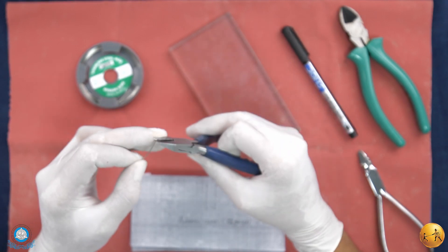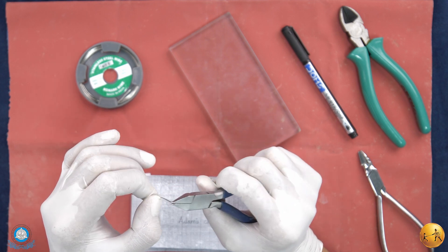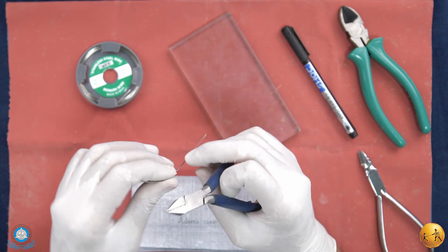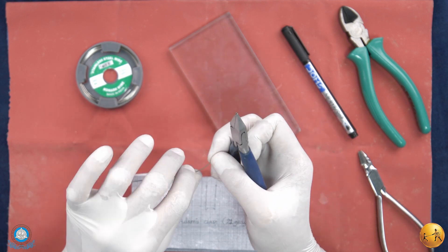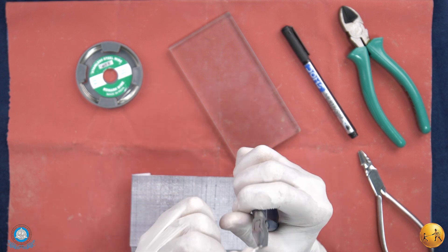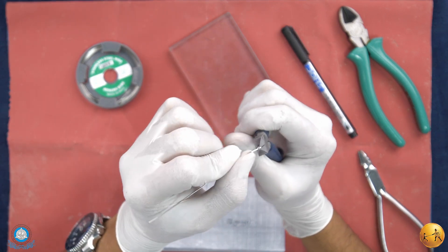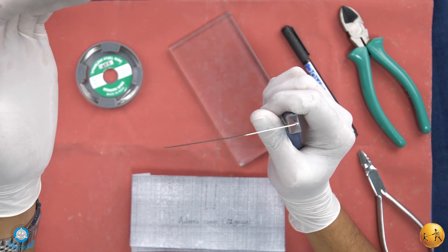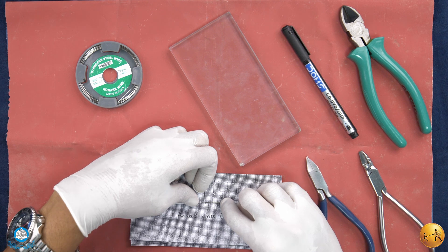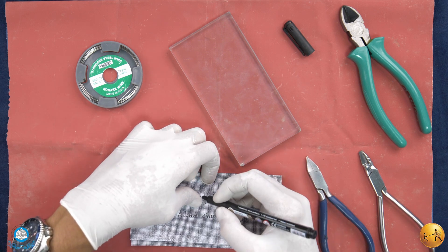Using your Adams plier, straighten your wire. Once the wire is nearly straightened, keep it on your outline and with a permanent marker mark two points.